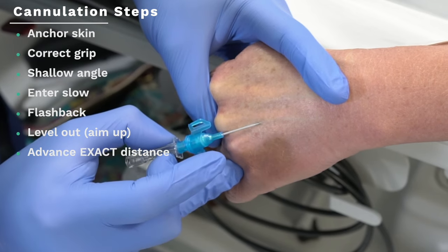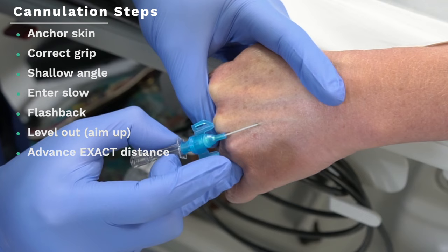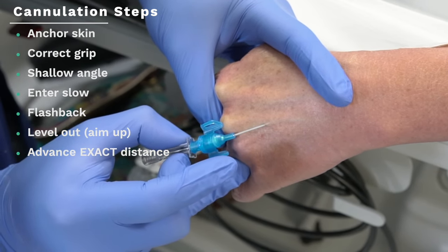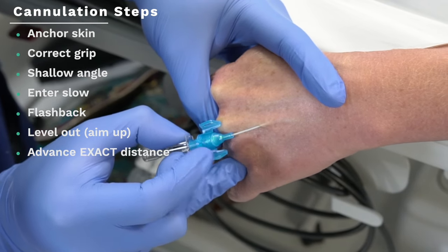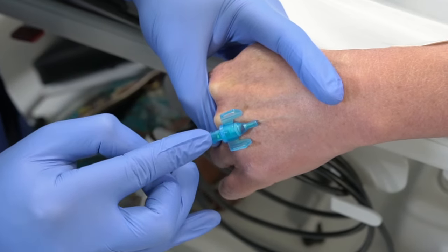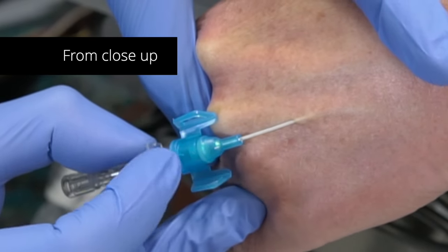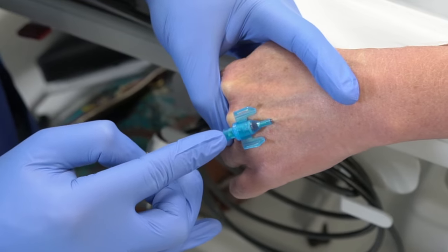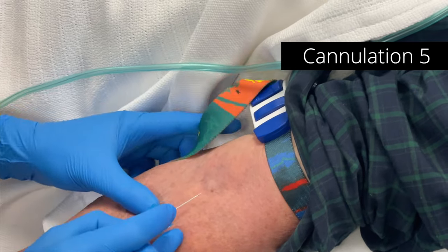Because the vein is so superficial, my angle isn't even five degrees — it's almost parallel to the vein because I know it's really superficial. In my other cannulation demonstrations in the cubital fossa, the vein is just marginally deeper, so I use a steeper angle of even five to ten degrees. Just to highlight my grip: it's thumb and middle finger, which allows me to visualize the flashback, and then I can push off the cannula with my pointer finger with very little change to my hand structure.